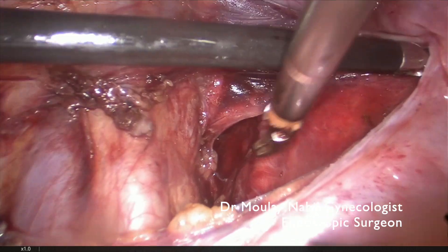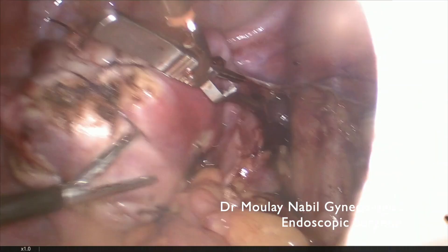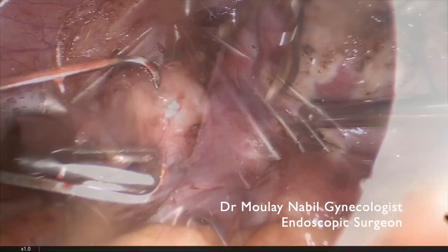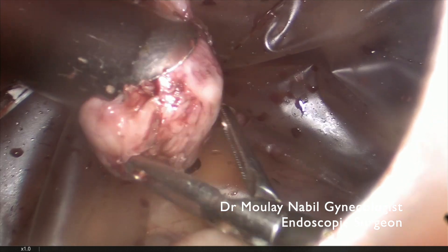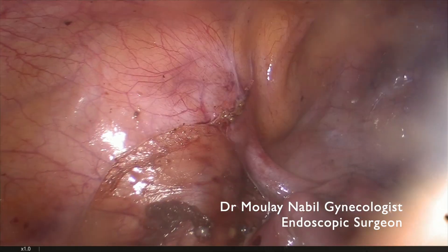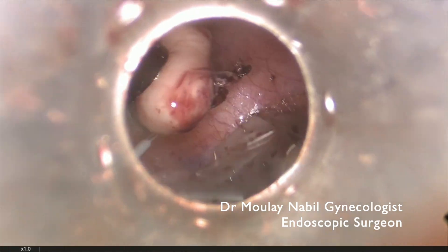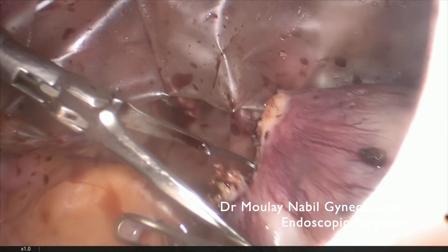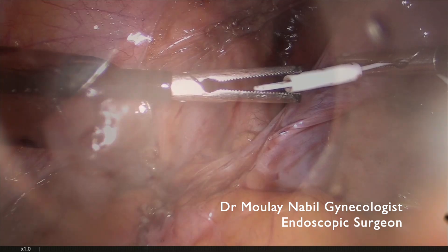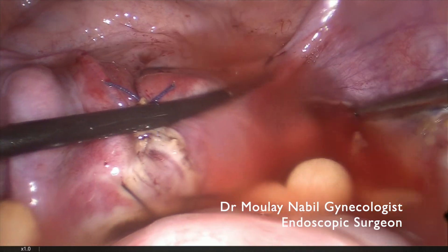We remove the bulldog clamps before morcellation to confirm there is no bleeding after their removal; any residual bleeding can be controlled with bipolar. We also verify there is no bleeding in the retroperitoneal area. We then begin morcellation inside the endobag. Even with numerous myomas, this procedure can be performed safely. After complete morcellation, we remove the endobag, clean the pelvis, and the challenging surgery is complete.